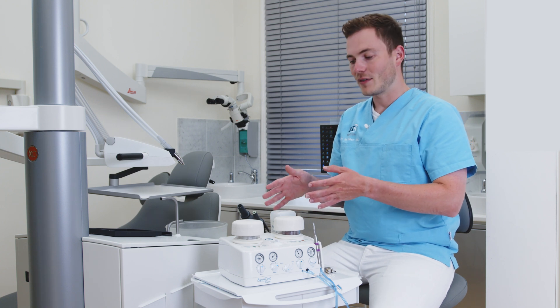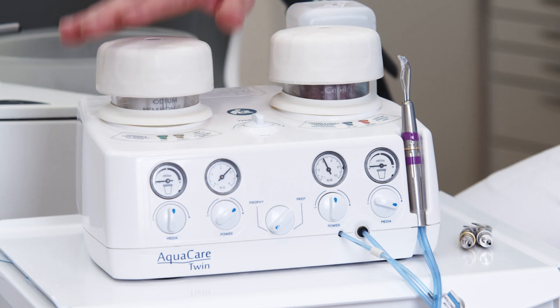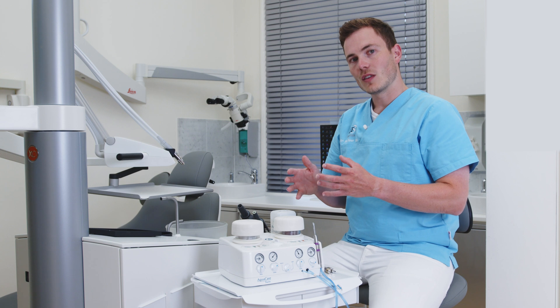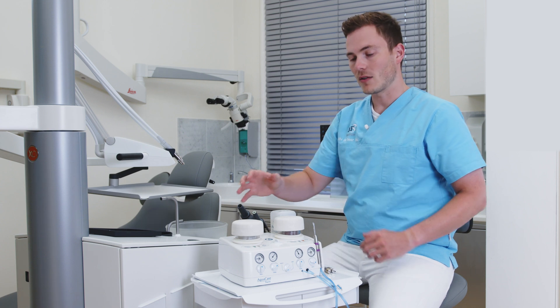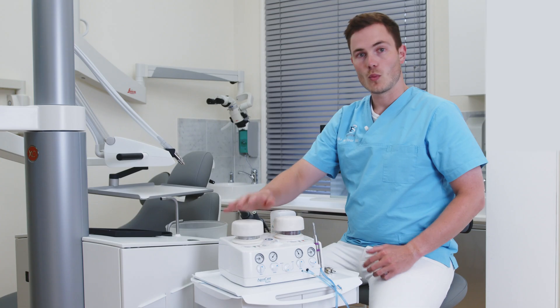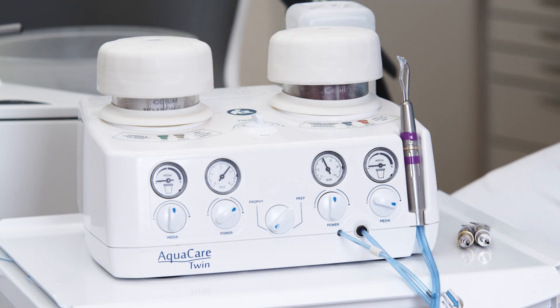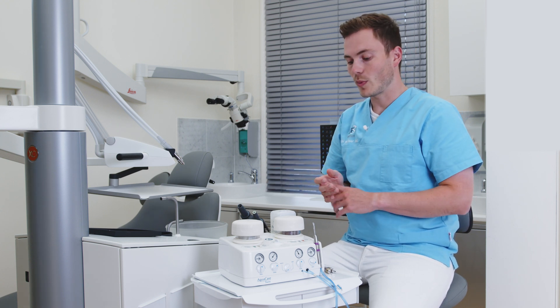Before me I have the AquaCare twin, which means that I have two compartments — here on the left and here on the right. The benefit of the twin compartment is that I can use, for example, prophylactic powder in the left compartment for stain removal, and I can use a cutting powder — the aluminum oxide — to prepare dentin and enamel.